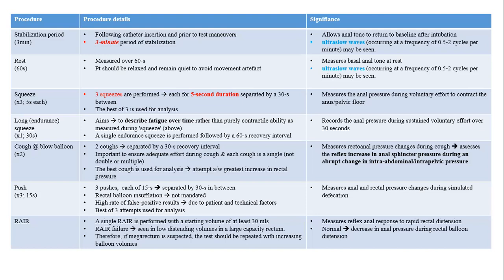After that, we move on to the endurance squeeze or the long squeeze, where we ask the patient to squeeze for 30 seconds, and after that a rest interval for 60 seconds. This reports the anal pressure during sustained voluntary effort for 30 seconds.